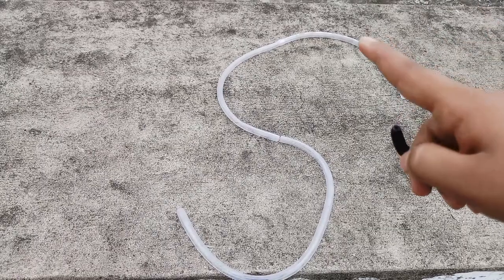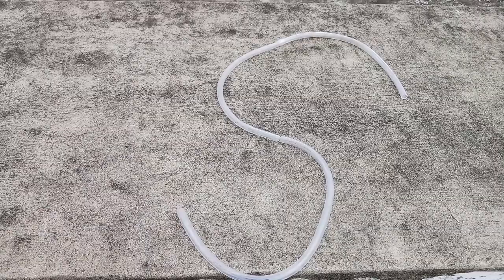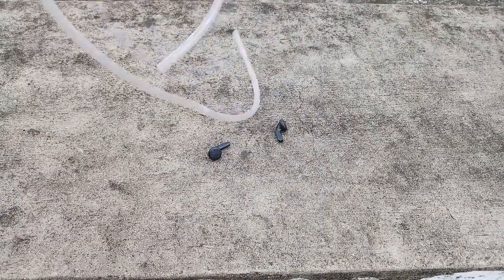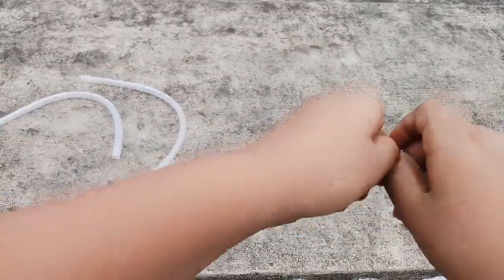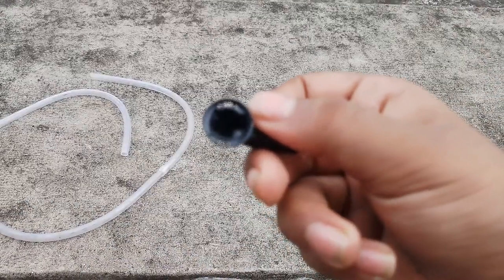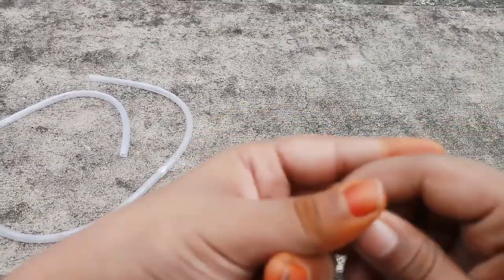See, this is a homemade stethoscope. The materials needed are one pipe, one plastic tube, and two earphones from which the speakers have been taken out — for not hurting the ear directly.